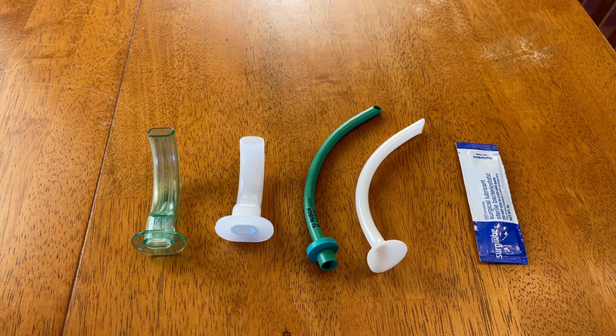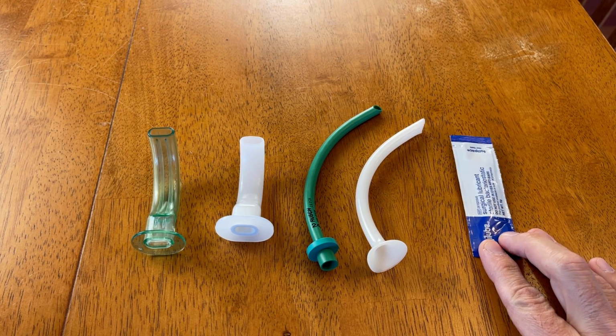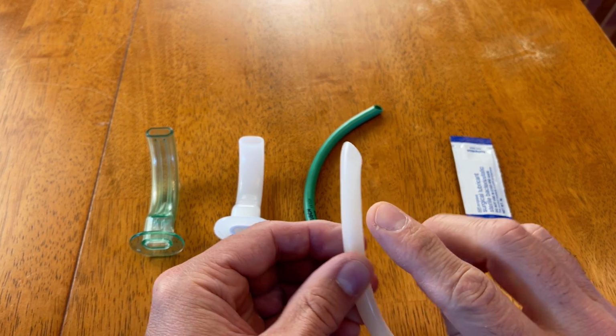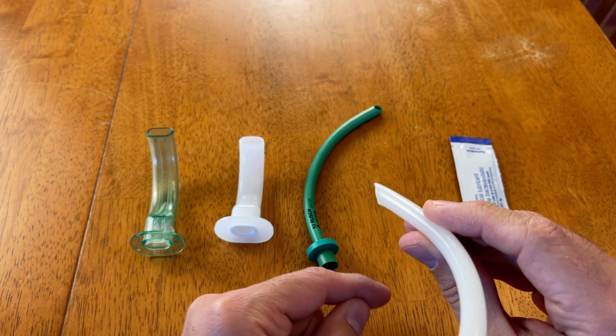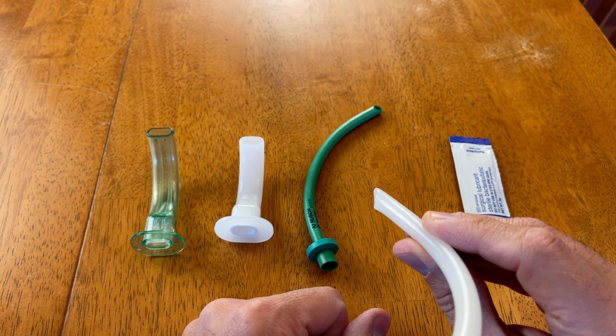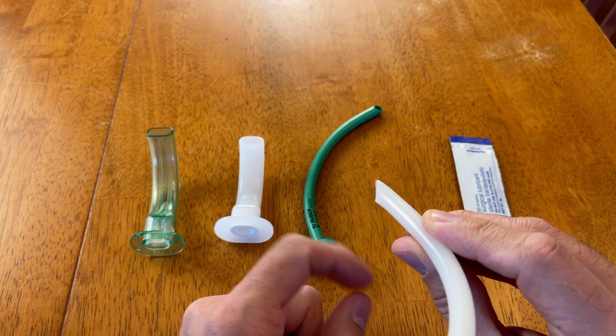As far as insertion goes, after you've assessed your patient and determined the need for the NPA, and you've properly sized and lubricated it with a water-soluble lubricant, you're going to insert the device with the bevel tip towards the patient's septum. So these are generally designed to be put into the patient's nostril with the bevel tip facing the septum.